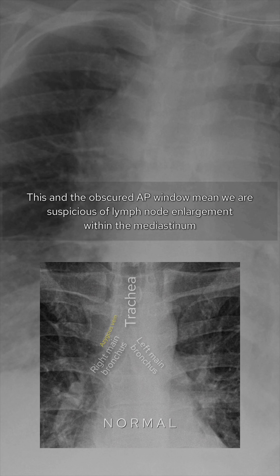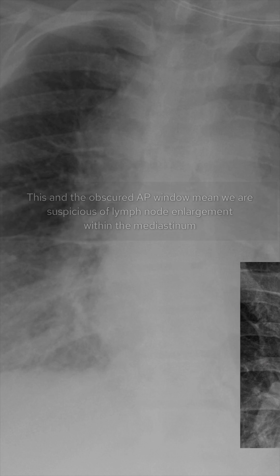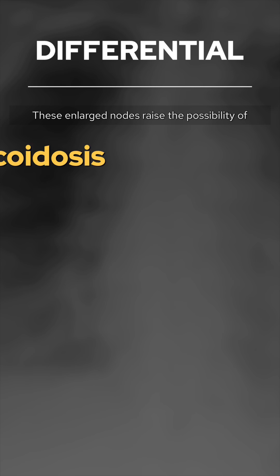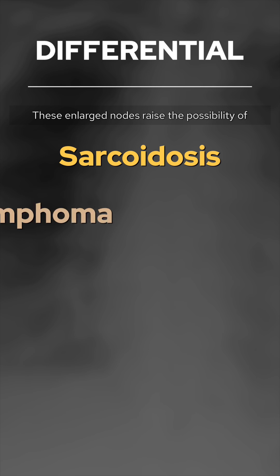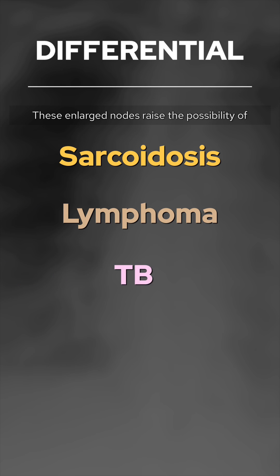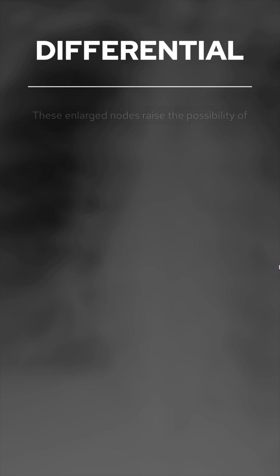This and the obscured AP window mean we are suspicious of lymph node enlargement within the mediastinum. These enlarged nodes raise the possibility of sarcoidosis, lymphoma, and TB.